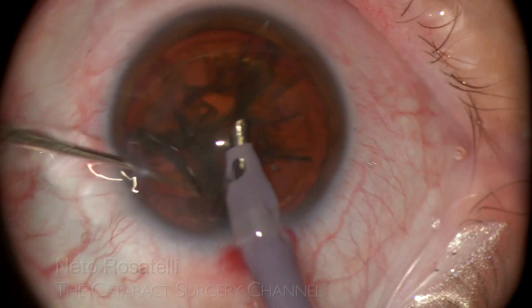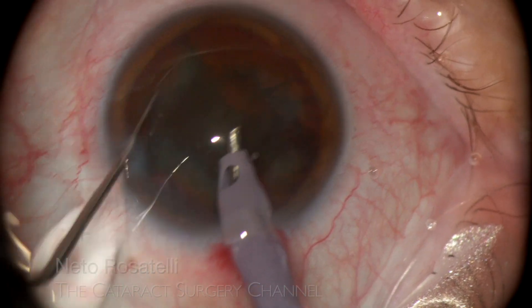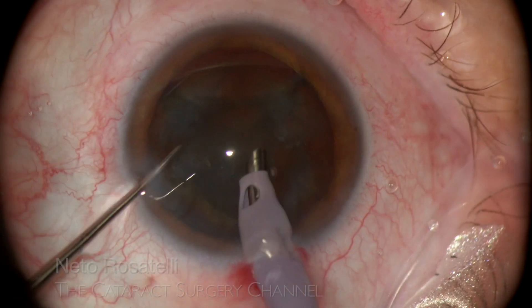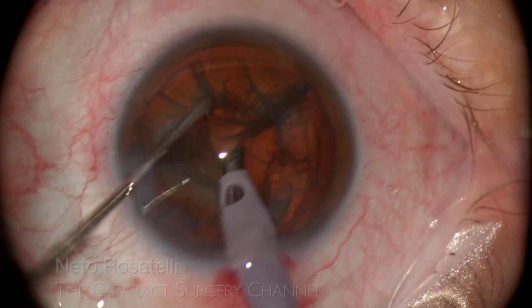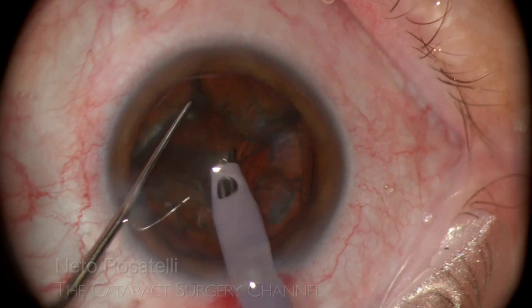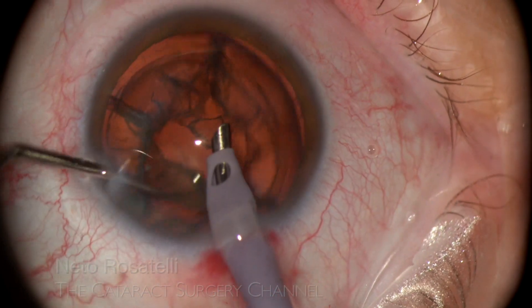After fracturing, I do a little nucleus spin in both directions to help release whatever cortex is still attached. The chopper assists in presenting the nucleus pieces to the safe zone position at the phaco tip. This long chopper is really helpful in that.